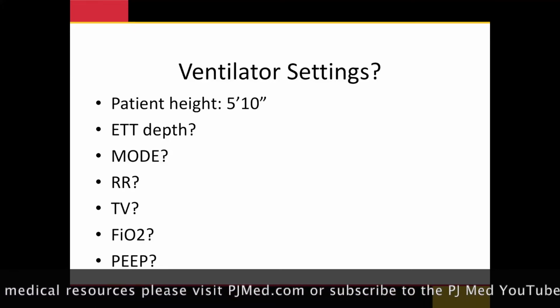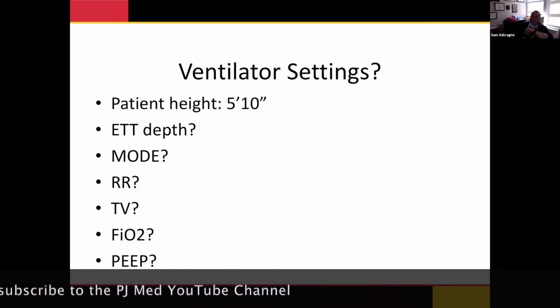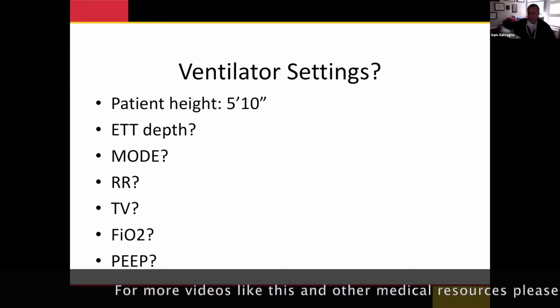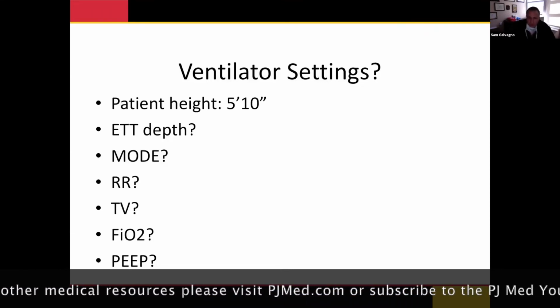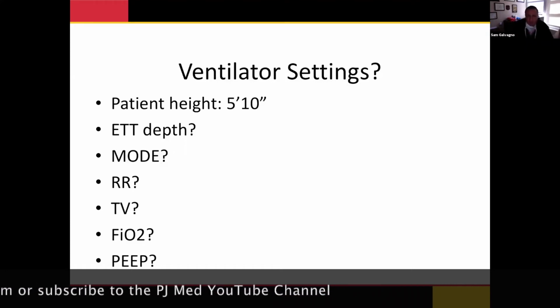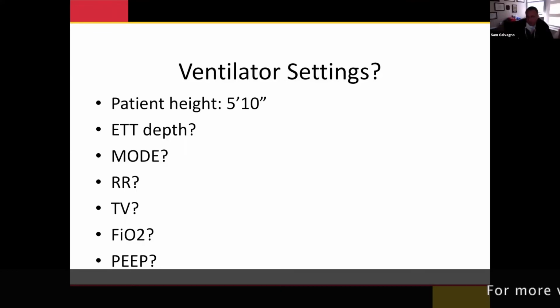It'd be like 400 on the tidal volume. Okay. And how'd you get that? You did the calculation somewhere where you looked at the card? Yeah, I used the app. Okay. Or one of your cheat sheets that we made for you. Okay. Either way, yeah, that's fine. And that puts you in the what, 6 mils per kg predicted body weight range? Is that what you got for that one? That's just over 6, so that might be somewhere around 7. That's okay. Yeah. Great. I agree with that.